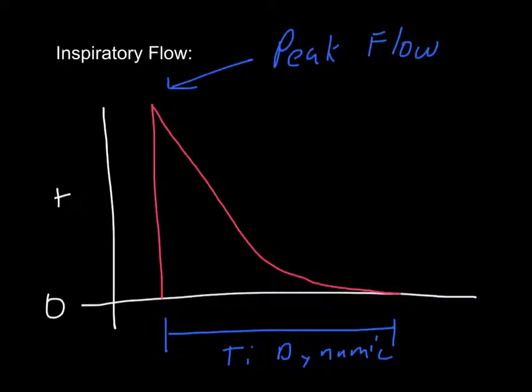So in this slide, I'm going to introduce a couple of new elements, and we're going to take a close look at the inspiratory flow, just separating it out from all the other waveforms that we've been looking at. When the ventilator first clicks in and we first trigger our breath, we get a very high peak inspiratory flow established, and I'm going to describe why that occurs. And then we get this kind of logarithmic decline in inspiratory flow until we reach a flow of 0 where there's no longer any flow.